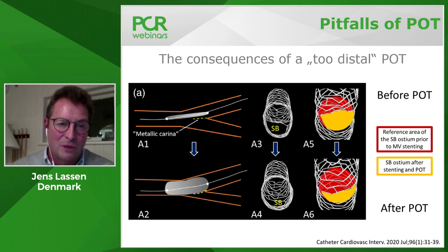And when you place the first stent in the provisional pathway, you need to have enough room proximal to the takeoff of the side branch for a balloon, which means, for most practical purposes, at least 8 millimeters of stent. Otherwise, you won't have a balloon that would be able to cover it if it's only six. Next slide, please.